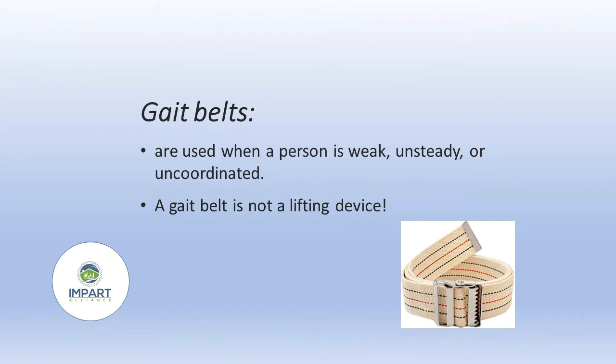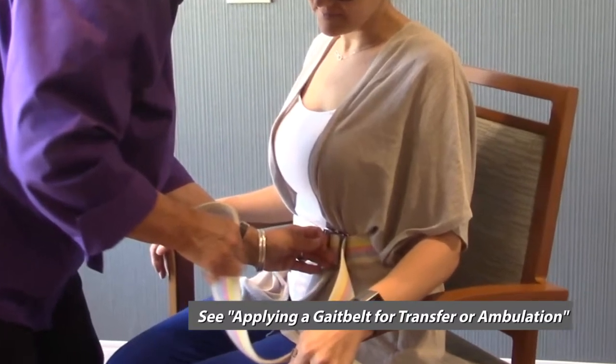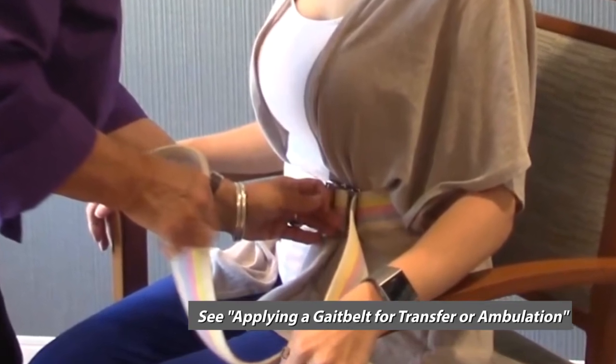Gait belts are safety devices used to assist people who are weak, unsteady, or uncoordinated. They are not to be used as lifting devices. Please see the video Applying a Gait Belt for Transfer or Ambulation for more information on how to put a gait belt on a person.